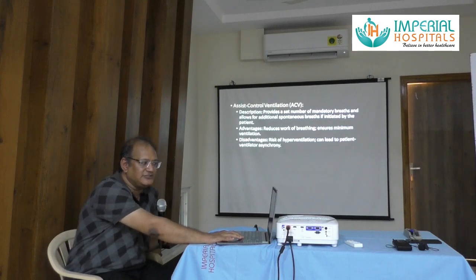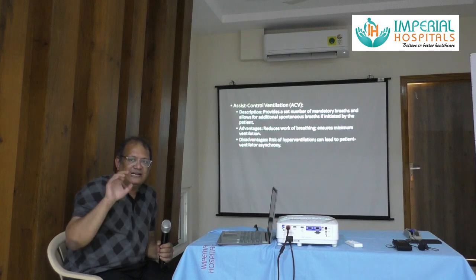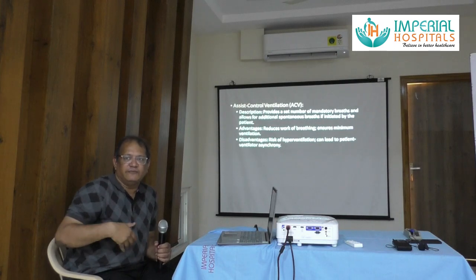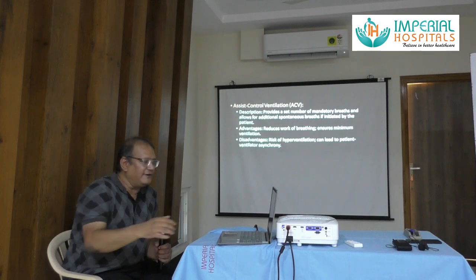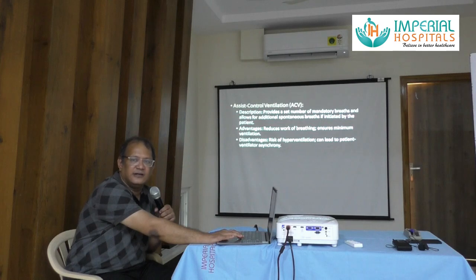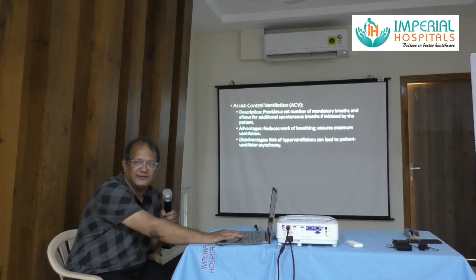Advantages is it reduces the work of breathing. That is, the moment the patient initiates the breath, the ventilator will push the air in, like it will increase the pressure and the air will go in. So the work of breathing will be taken over by the ventilator from the patient. And because we have set a mandatory amount of ventilation, we have ensured that the minimum ventilation to the patient can be delivered. Disadvantages is risk of hyperventilation, which can lead to patient ventilator asynchrony.